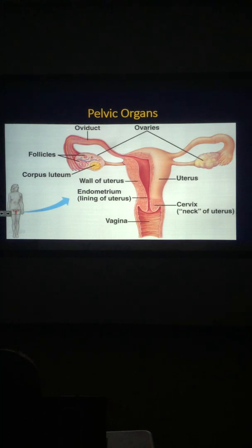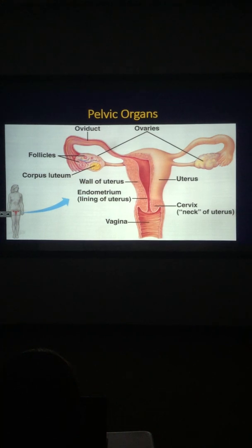Ultrasound gives you excellent anatomy, for example when the patient is pregnant. Ultrasound will give you excellent quality of the uterus and the baby, how the baby is moving, what the status of the baby is, whether there is any abnormality in the anatomy of the baby, what the physiology of the baby is, what the heart rate of the baby is, everything can be told. The only problem comes with the fallopian tubes. Fallopian tubes cannot be seen by ultrasound unless they are dilated, because they are quite thin structures.